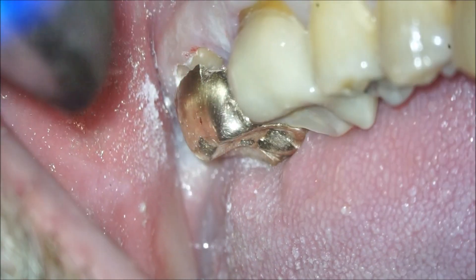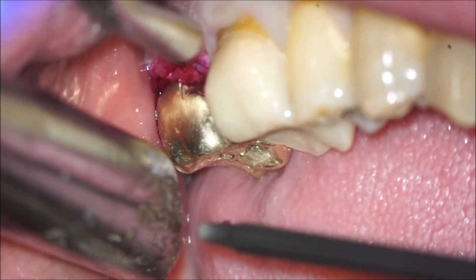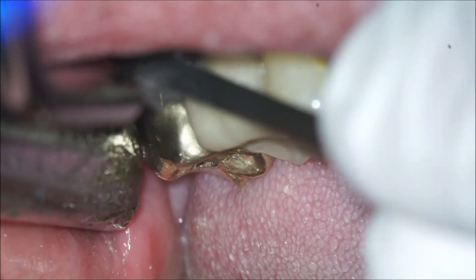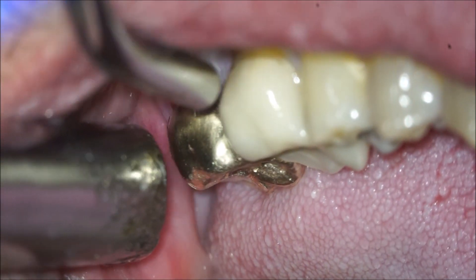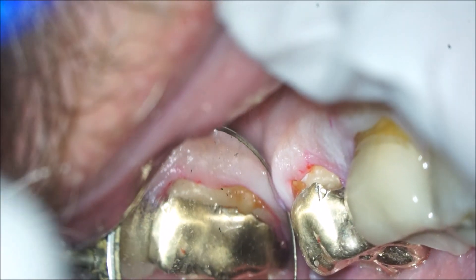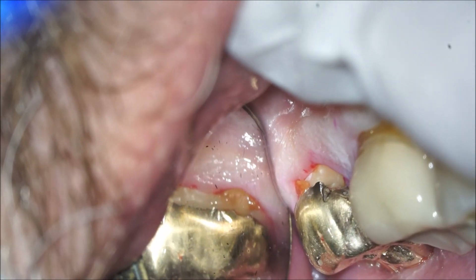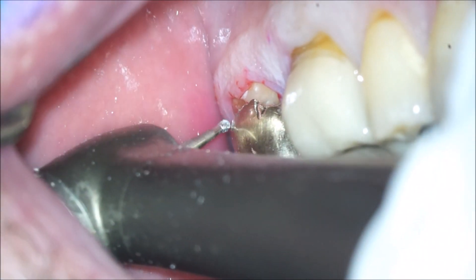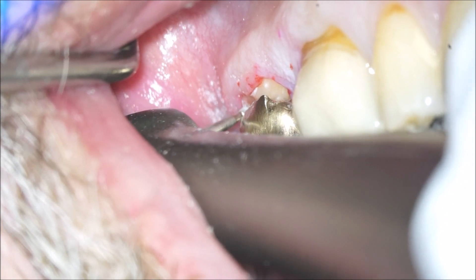You do have to be careful — you can see that one little area where the burr got away from me and rolled up on the margin of the crown. That won't affect this in any way, but generally you'd like to try to avoid that. So I think I've got it all out. I'm applying some caries dye here, which goes on and quickly gets washed away by the assistant. We'll take a look and make sure everything is fully cleaned out. There's still a little bit of area staining on that distal buccal, so I do want to go back and get that little bit off. With the slow handpiece speed, I'm coming in and will wipe that away quickly.